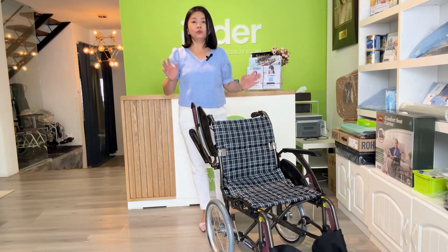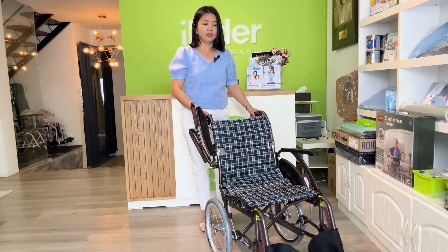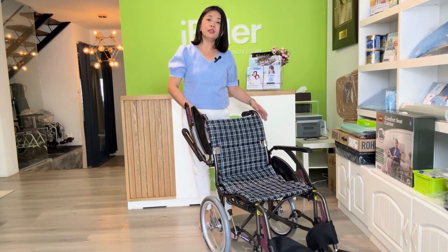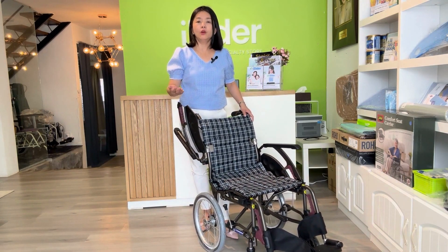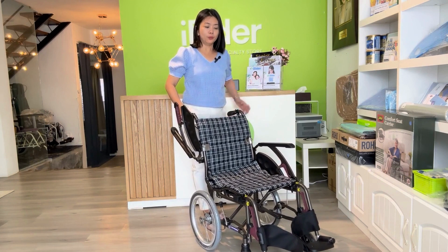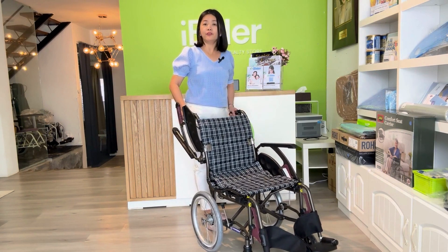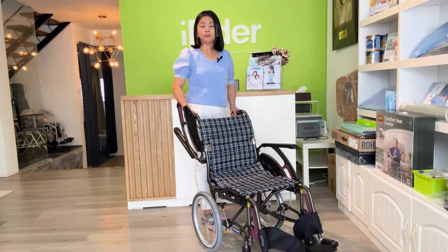As compared to other wheelchairs, when you use this Kawamura wheelchair, you can find that it not only gives your user optimum comfort, but also eases the caregiver's job. As a caregiver, you put the same person, same weight, into this wheelchair versus another wheelchair, and you can find that this wheelchair is easy to push them to many places with minimum energy.